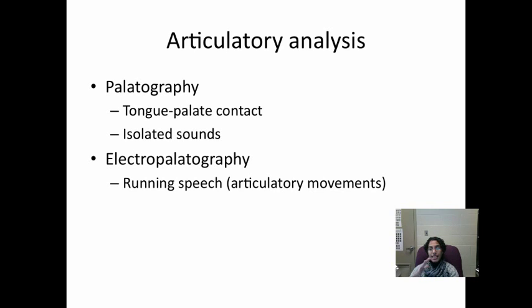Okay? So that sums up our peripheral systems that we talked about, and some of the instruments that are available that can help us measure airflow, pressure, lung volume, articulatory analysis, and laryngeal function: EGG, the flexible endoscopy, rigid endoscopy, video stroboscopy. That's the one that's going to give us more information about the vibrational characteristics of the vocal folds. These are some things that I want you to really pay attention to.